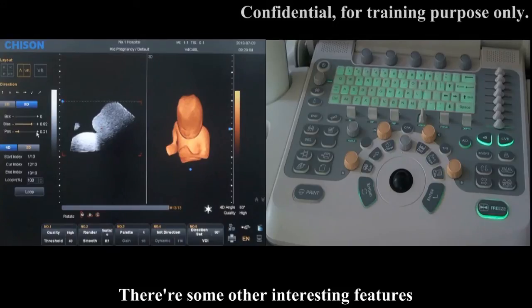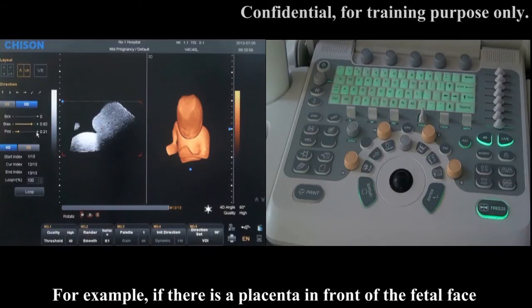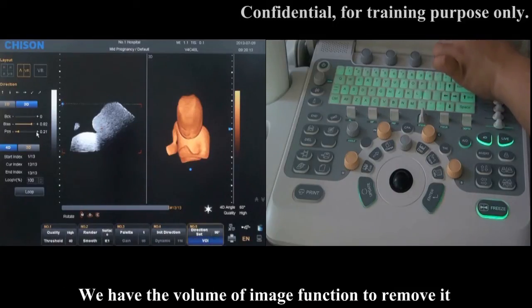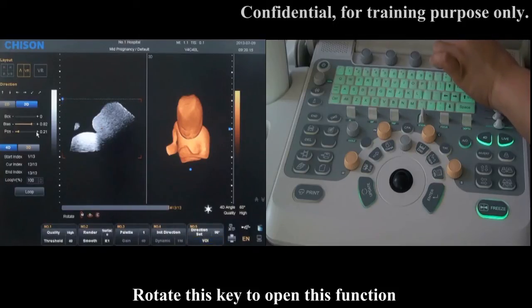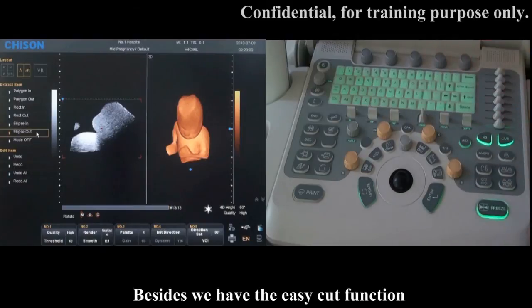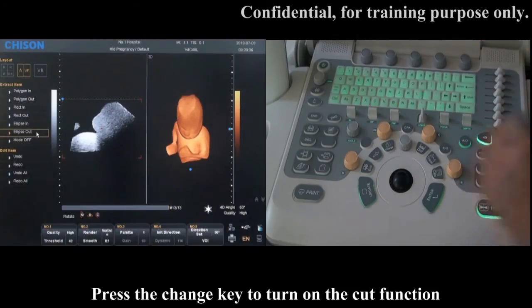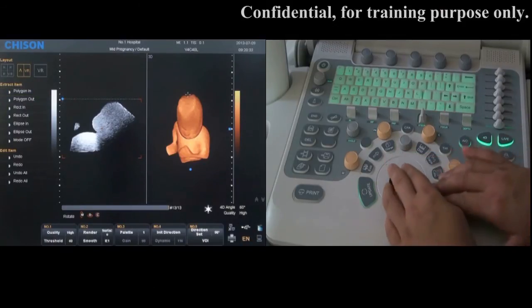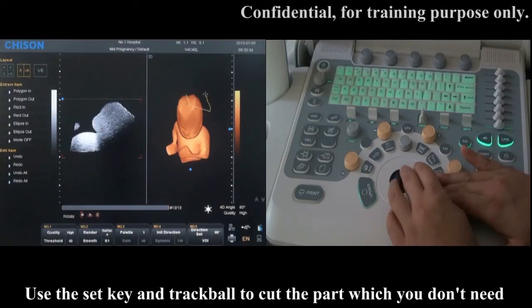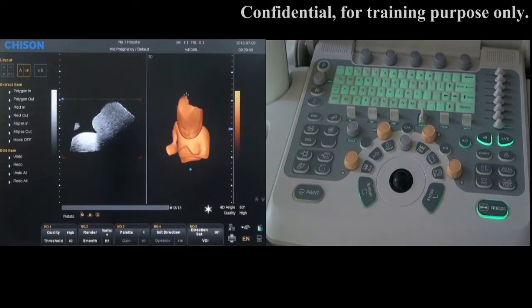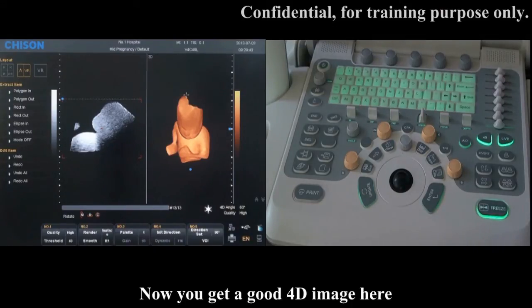There are some other interesting features. For example, if there is a placenta in front of the fetal face, we have the volume cut image function to remove it. Rotate this key to open this function. Besides, we have the easy cut function. Press the Change key to turn on the cut function, and choose the cut method as you want. Use the Set key and trackball to cut the part which you don't need. Now you get a good 4D image here.